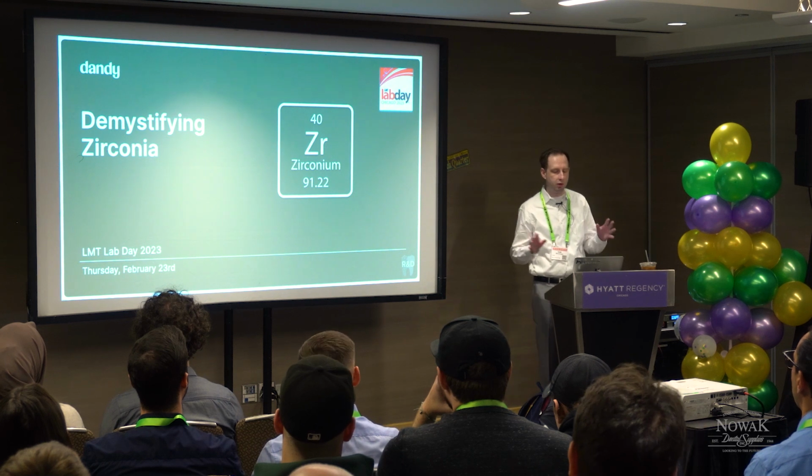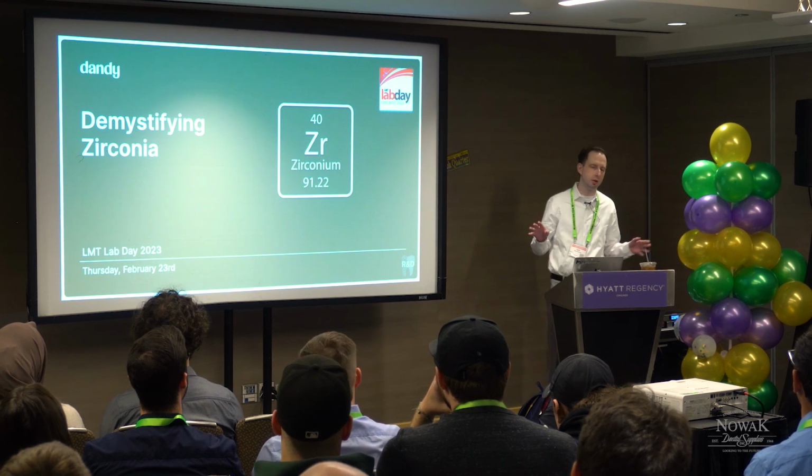So, demystifying zirconia a little bit. You all have known zirconia. It's been around for a long time. It's back in the mid-2000s with 3M, and even Procera with aluminum. But zirconia has really evolved a lot over the past 10 years, as you all know. It's really competing with e.max correctly now, with the next generation, which is a lithium disilicate, and others. And it's now the most used material in the dental industry.